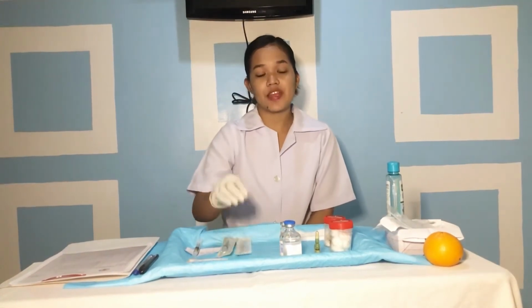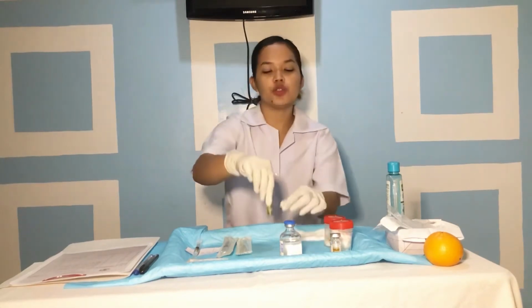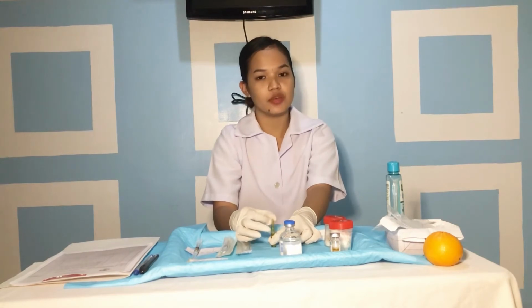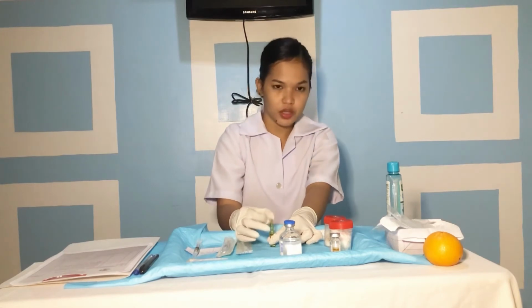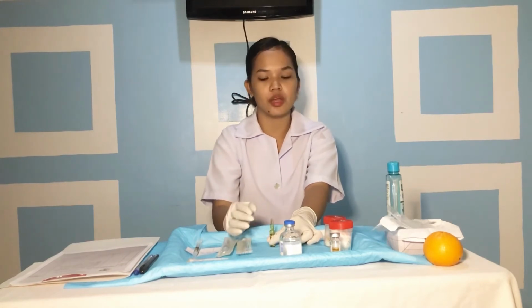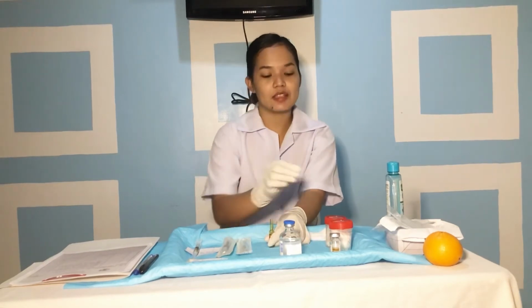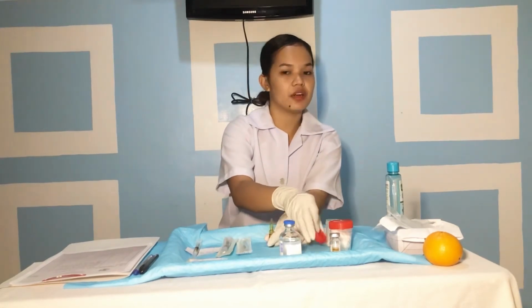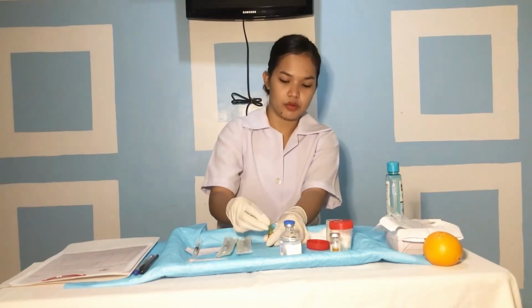So next is the ampule preparation. This is an ampule. We tap the top of the ampule lightly and quickly with a finger until fluid moves from the neck of the ampule. This will dislodge any fluid that collects above the neck of the ampule, and all the solution moves into the lower chamber. We place a small gauze pad or an opened alcohol swab just above the neck of the ampule.